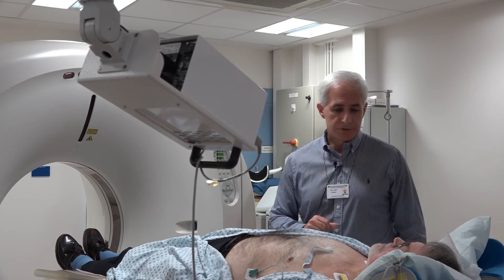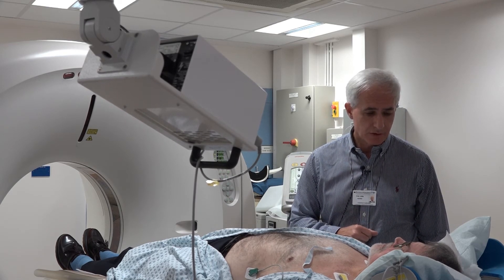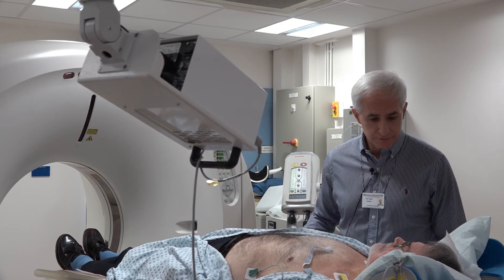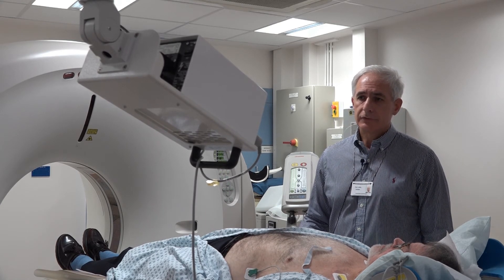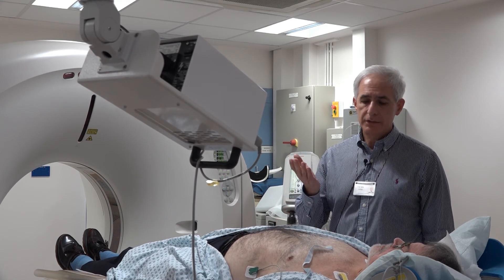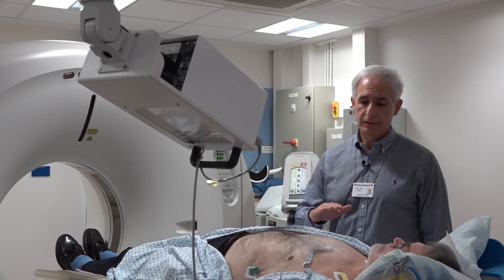Before we start the procedure, I would like to do a breath hold exercise with you to see how well you can cope with this breath hold request. Are you comfortable at the moment? So just relax yourself for a moment, and when you are ready, take a nice and easy breath in and hold it. And slowly breathe away.